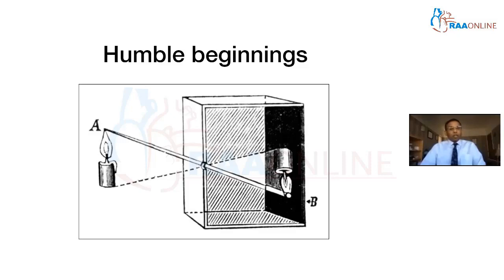Now, if we can project the same concept as an analogy to the human eye, you can visualize that the pupil of the human eye acts as the pinhole that is shown here in the middle of the picture, and the retina is the black film on the back surface of the pinhole camera. Now, the only difference here is that an independent observer could not see what the image is falling on the retina unless we have the eye sliced in a sagittal plane and look at it from the side. It's a bit too far for practical purposes.